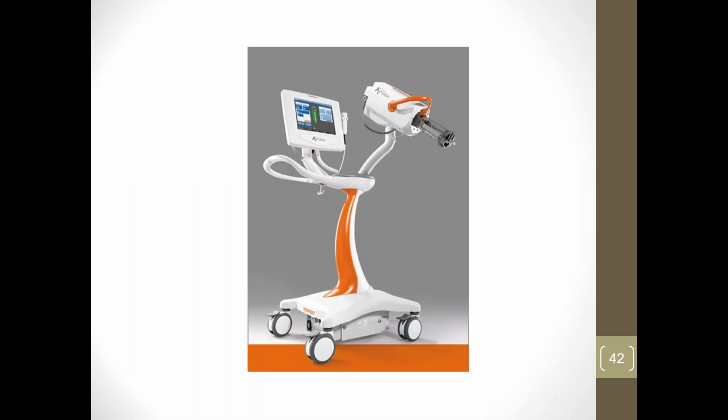And so here's your Mark VII, kind of modern-day contrast injector. And these are a little more, how should I say, regulated and controlled than using a bolus from a syringe to inject the patient with.